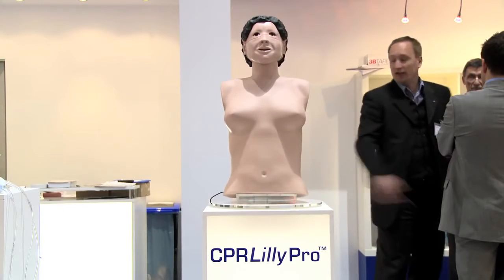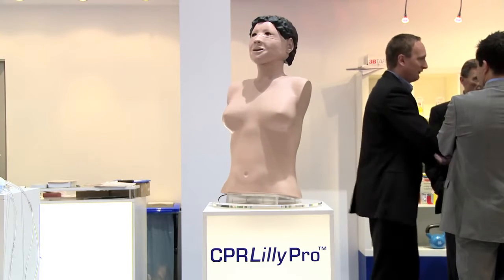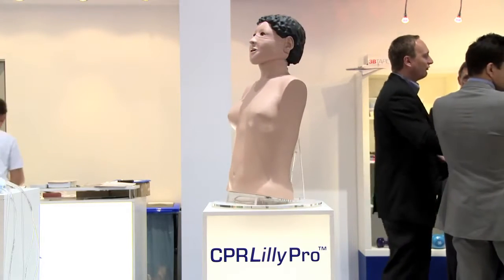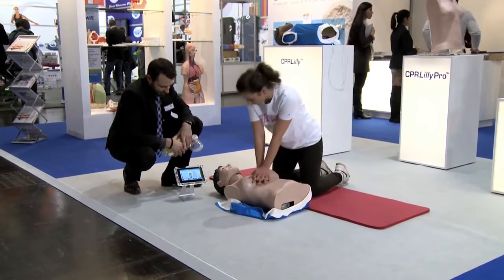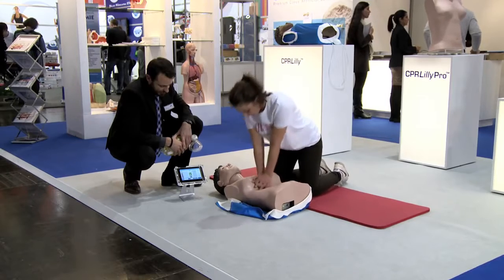The CPR Lily Pro comes with a new and innovative feedback system to improve the quality of your CPR training. The performance of the student can be shown and evaluated with our new training software.